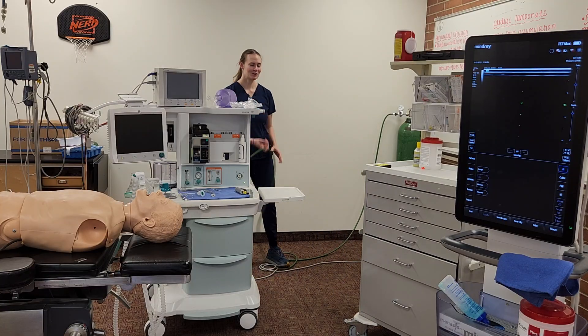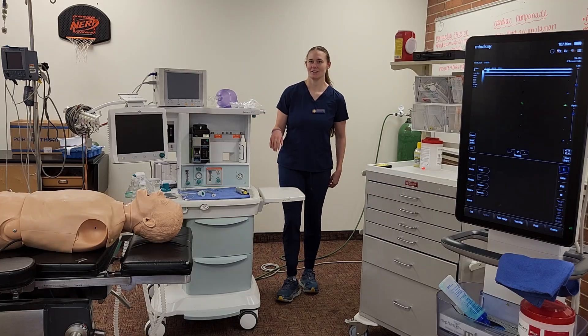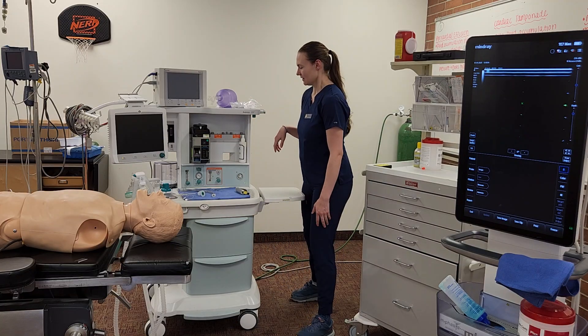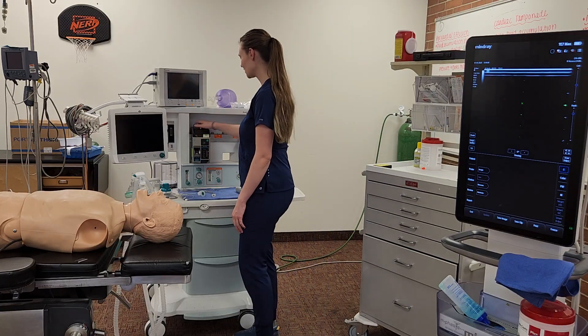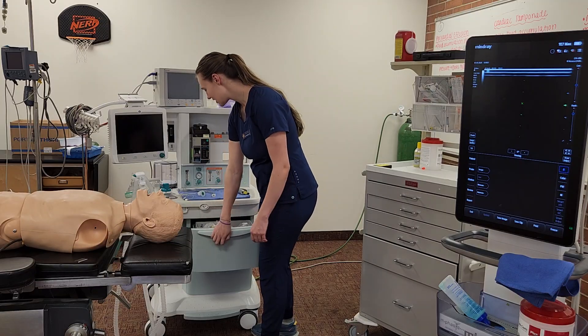I'm going to make sure it's plugged into power, and make sure my tanks and pipe pressure are hooked up. I'll make sure my tank pressure is above 1000 for my oxygen, above 745 for my nitrous, and then I'll make sure I have the Ambu bag. Then I'll go around to the front, check out my interlock system, check my gases, and make sure the cap is screwed on tight.